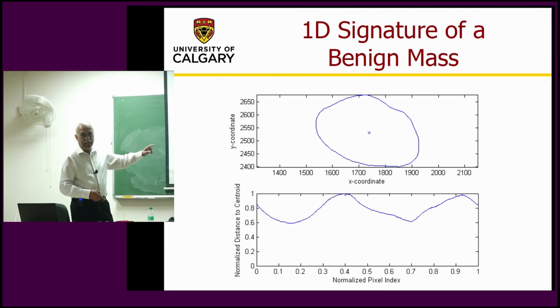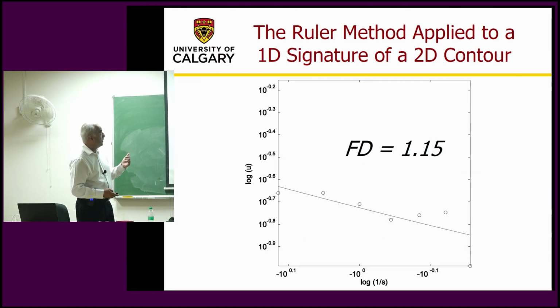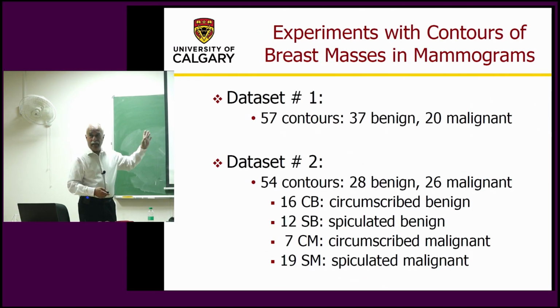If it is a straight line, it is 1. It is not a straight line. Is it a fractal? Not really. I can't see much of self-similarity and scaling. There is similarity, yes, there are some waves. Is there scaling? No. So the dimension is low, 1.1. Whereas for the other one, you get more. I'll show some numbers later.